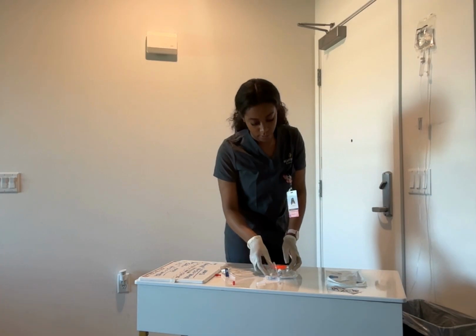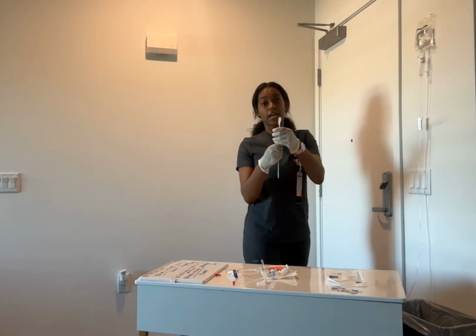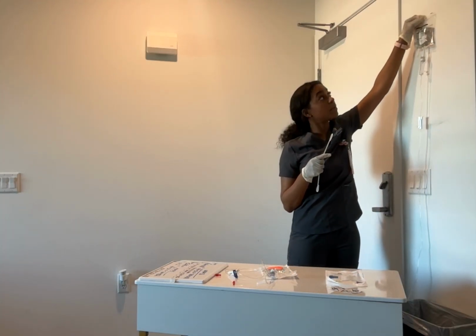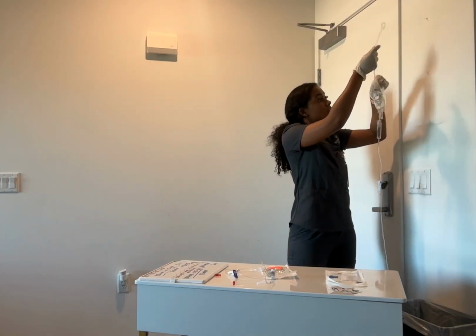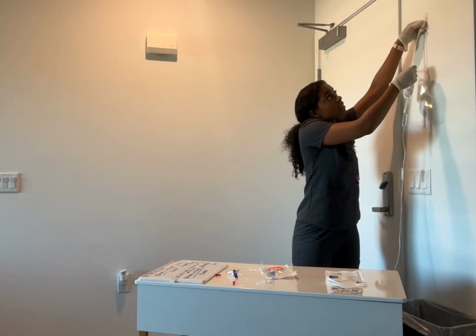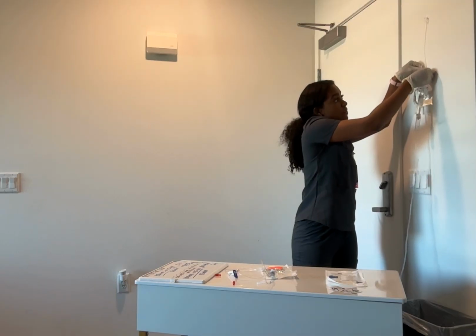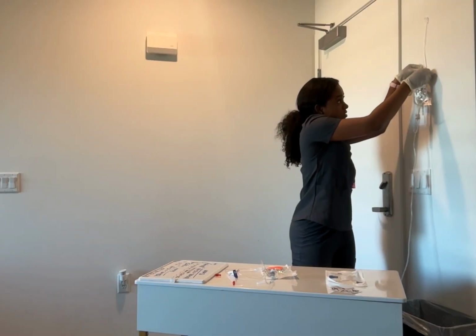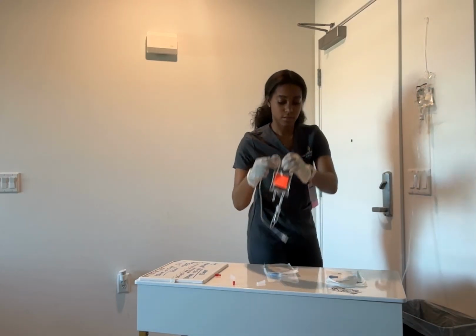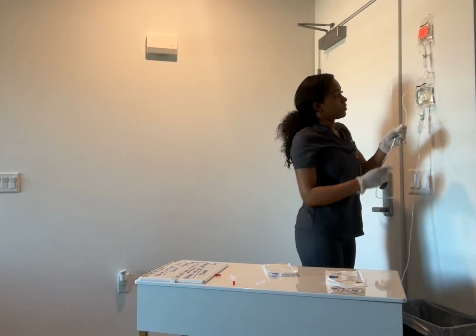So then we want to make sure that this is 30 inches above the IV site. So we're going to take this primary bag and we're going to bring it down. We're going to clip it to the bottom. We're going to take the secondary and make sure that the secondary is above the primary, because that's the medication that the provider ordered. Perfect.